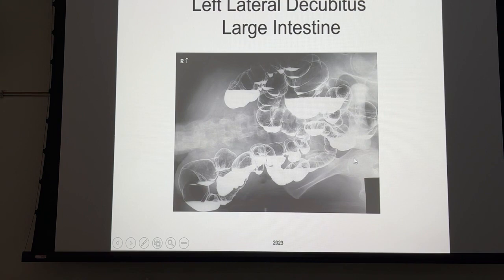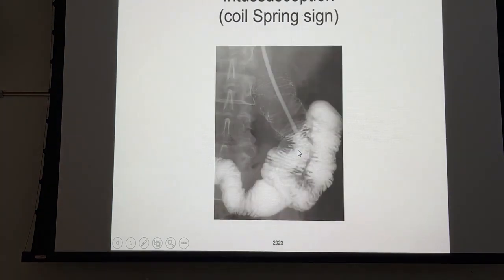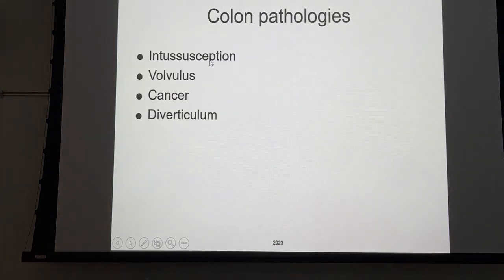And the exact opposite here, we've got the splenic flexure much higher in this case than the hepatic flexure. So we're looking for air in the lateral side of the ascending colon and the medial side of the descending colon. So common pathologies, what we see are diverticulum more than anything else.